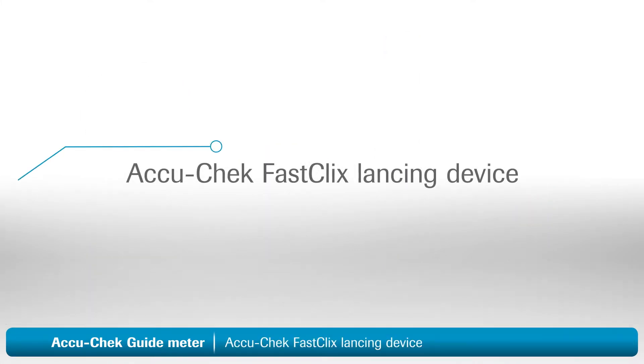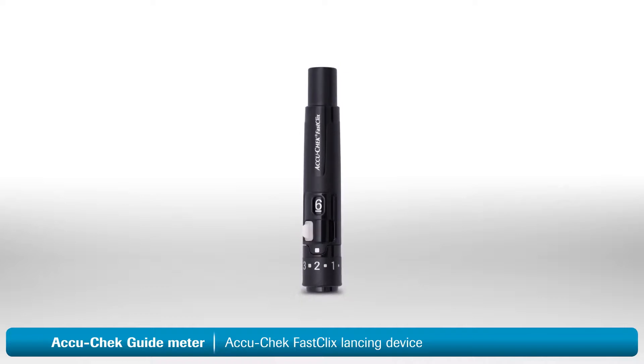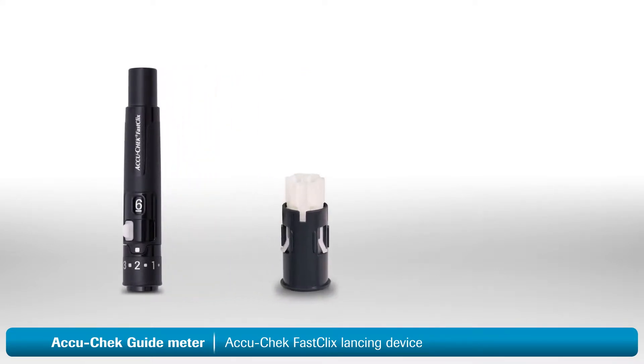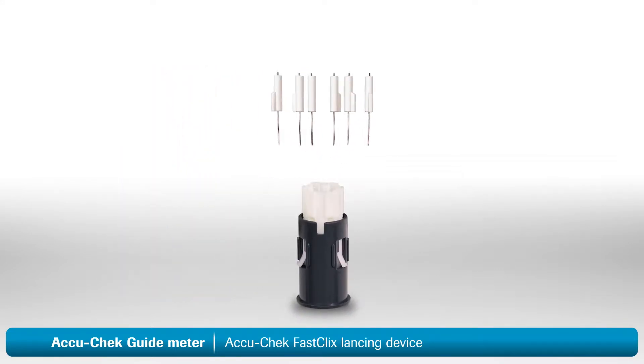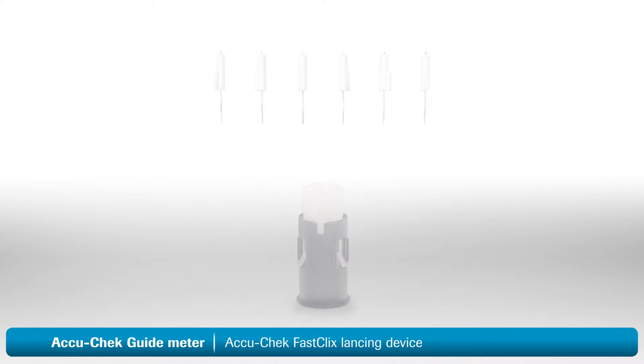Next, let's walk through setting up and using the AccuCheck FastClicks lancing device. With this lancing device, there are no individual lancets to handle or dispose of, making it much easier to use. First, you will need to load your lancing device. You will need an AccuCheck FastClicks lancet drum. Each drum contains six preloaded lancets, so when you load one drum, you're actually loading six lancets.